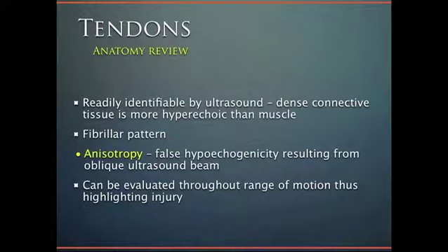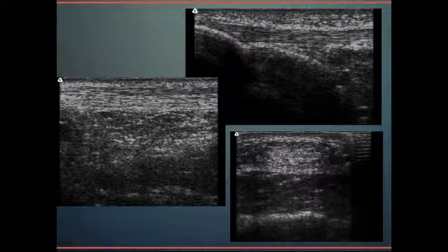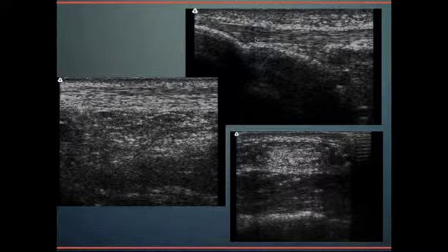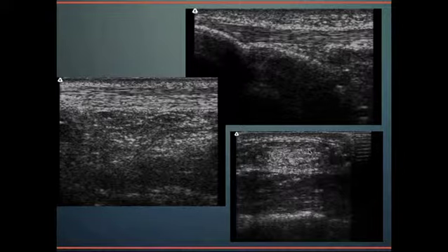Tendons should be readily identifiable on ultrasound because their connective tissue is so dense it looks very hyperechoic — especially more hyperechoic than muscle. It exudes a fibrillar pattern and should be evaluated throughout its constant range of motion. If it's not present as you're ranging a joint, there may be an injury there. Here are three different regions where we see tendons, demonstrating the fibrillar pattern in both short and long axis views.